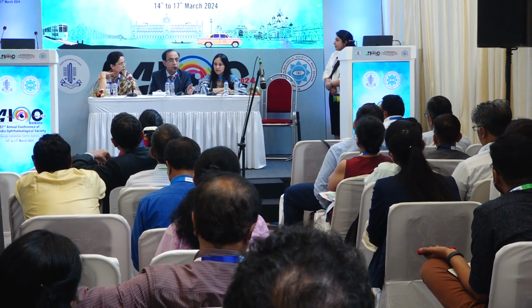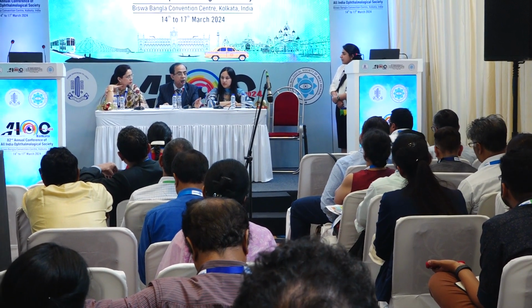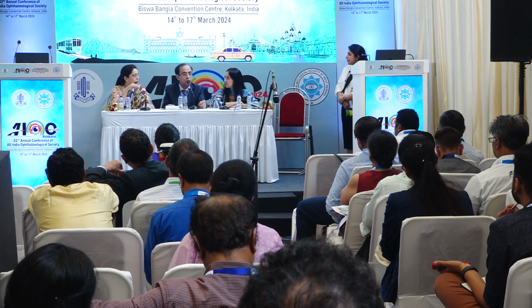But when you are chopping, probably you are more stuck. So while chopping, you need a little less phaco energy, and a pulse mode is better at that time. And for phaco aspiration, you can further lower the energy. Suppose, depending upon the machine, if you are using 40% for trenching, you can use 30% for chopping, maybe 25% for phaco aspiration. So as you keep going up, the power can be reduced, and the pulse mode is needed when you are doing the chopping and aspiration. But trenching you can do in a continuous mode.